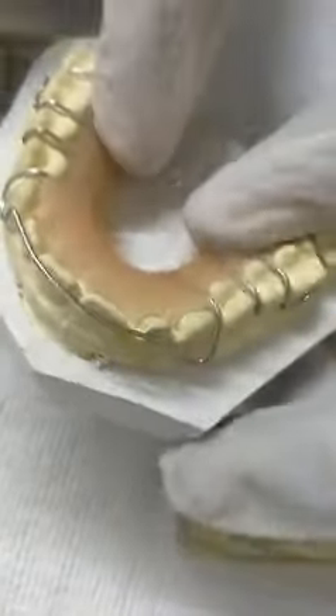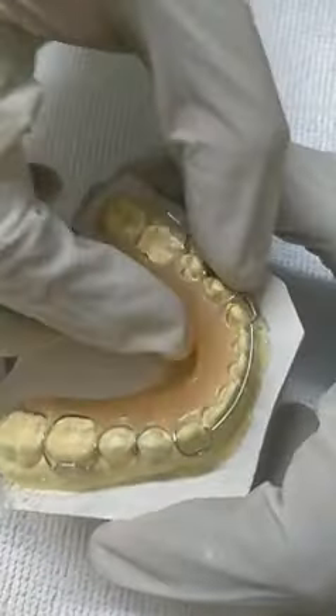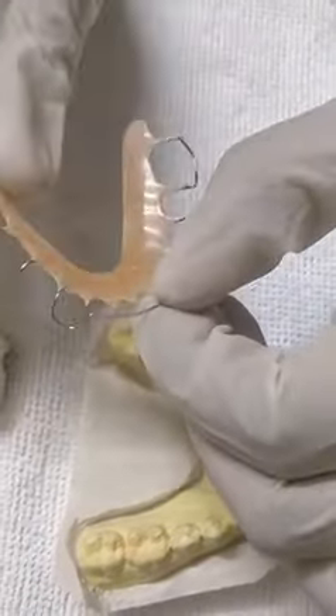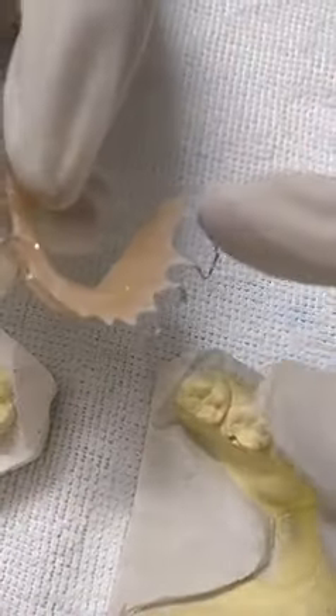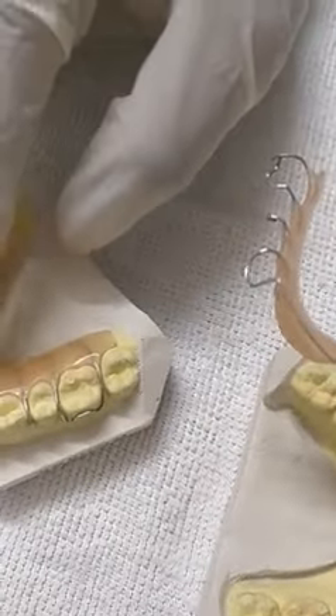And then you can wear it. For the lower, this is 22 gauge stainless steel wire — 2 Adams clasps, 1 Pinhead, and 1 labial bow. You can tighten them like this.